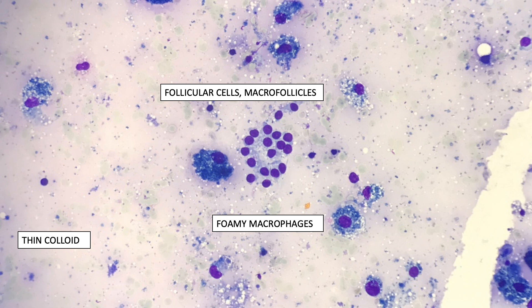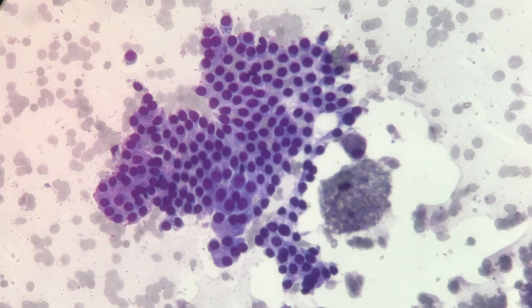You can often see cells with scant cytoplasm with an atrophic appearance, and also thin colloid in the background and foamy macrophages.